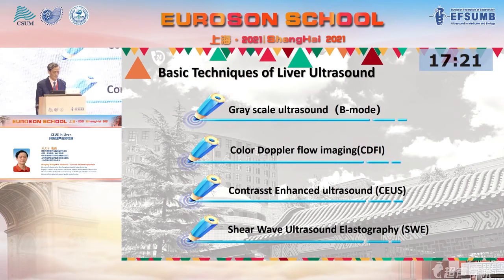As you know, ultrasound techniques include grayscale ultrasound, color Doppler flow imaging, contrast-enhanced ultrasound, shear wave ultrasound elastography.